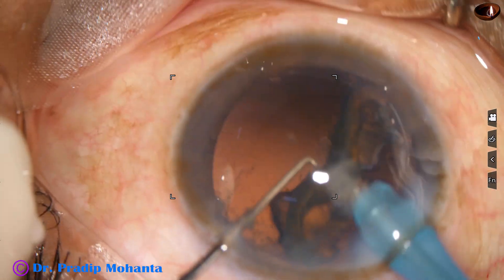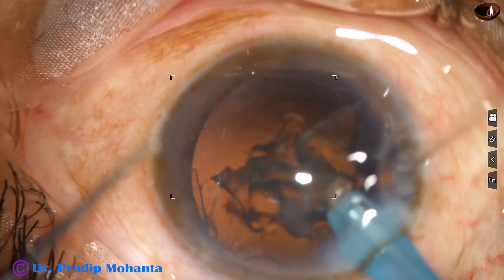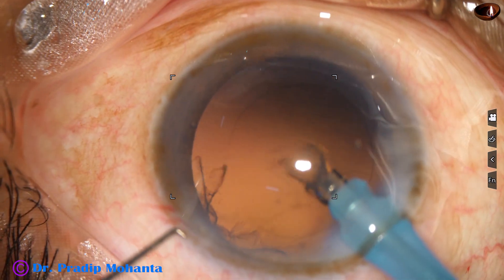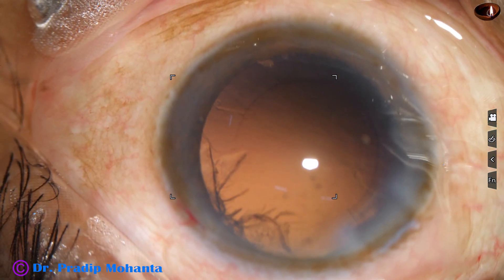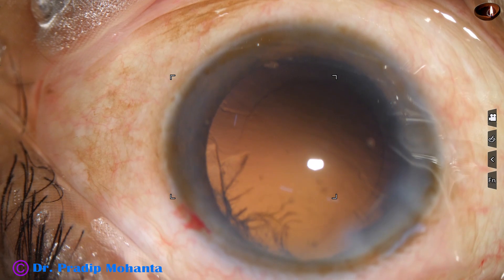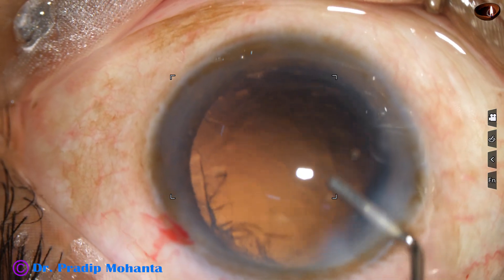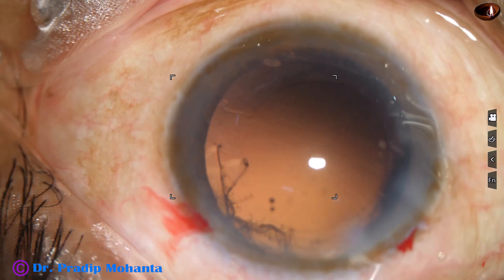More caution is taken to remove the epinuclear shell. As the epinucleus is removed, the chopper has been removed to maintain the anterior chamber better. Some viscoelastic is used to fill the anterior chamber, which will maintain it better.